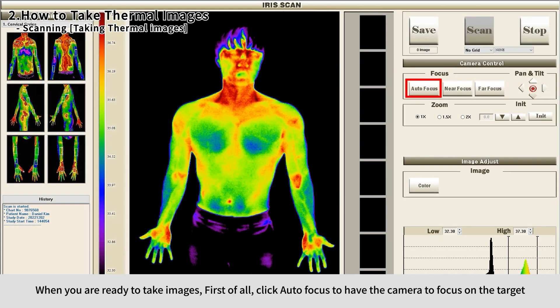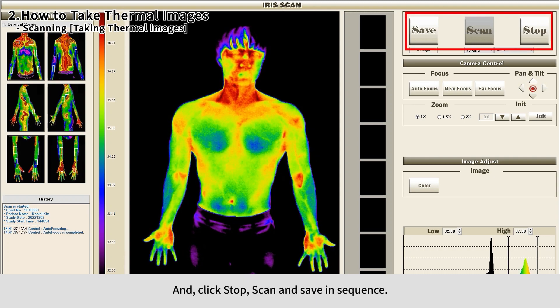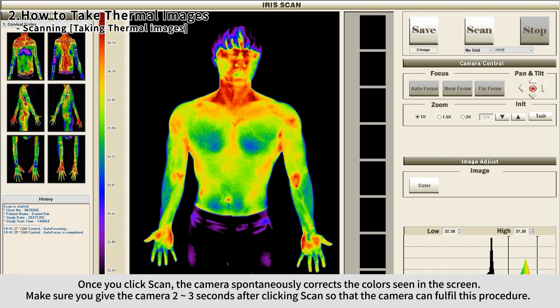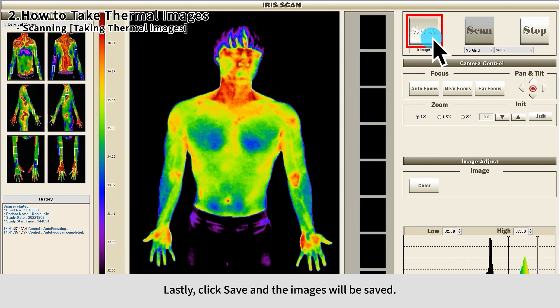When you're ready to take images, click Auto Focus to have the camera focus on the target. This button allows the camera to detect accurate temperature. Click this button and wait until the camera gets ready, then click Stop, Scan, and Save in sequence. Once you click Scan, the camera automatically corrects the colors on screen — give it two to three seconds to complete this procedure. Finally, click Save and the images will be saved.